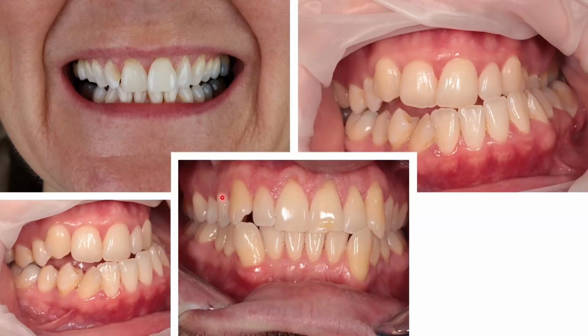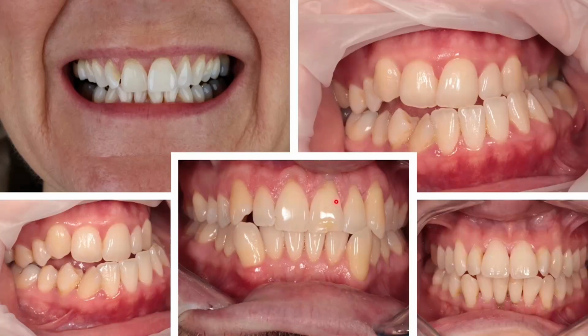And that is a case that would be extraordinarily hard to deliver with clear aligners. In fact, I did actually refer that case for a specialist orthodontic assessment, and it's currently under treatment. That ended up requiring extraction of 2 lower second premolars and about 2.5 years worth of fixed appliance therapy. So those severely crowded cases, particularly with roots lying in the wrong direction, they're best avoided.